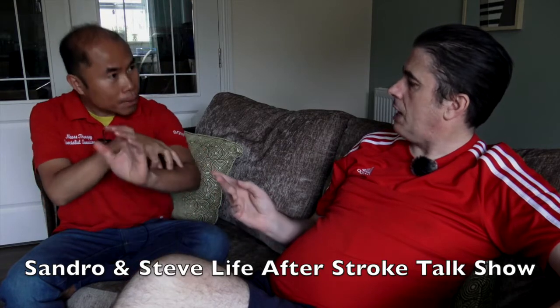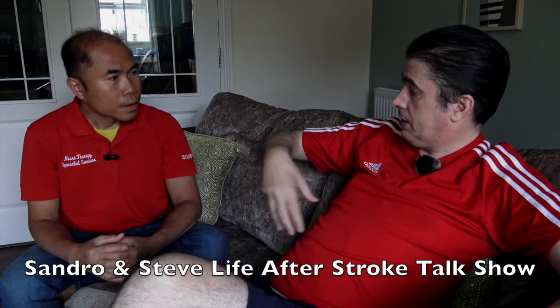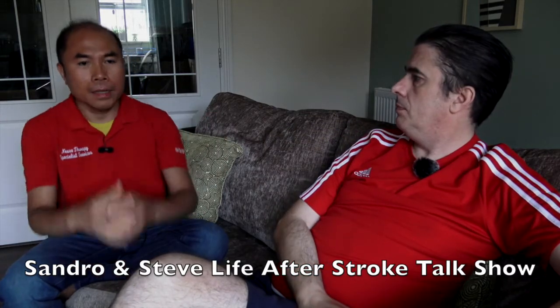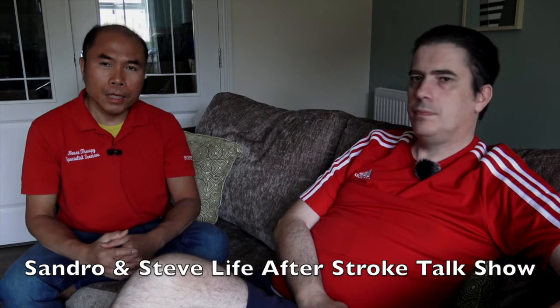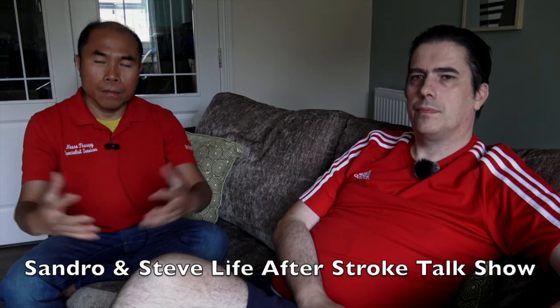So does it work along the same lines? Have you seen them ones on TV that you put on the stomach? You put the 6 stimulators on your stomach. The same principle. The same electrical signals are going through the muscles, but the way you use it in people with stroke is actually to relearn muscle control again, movements again.